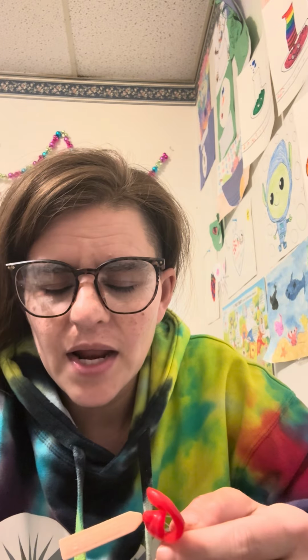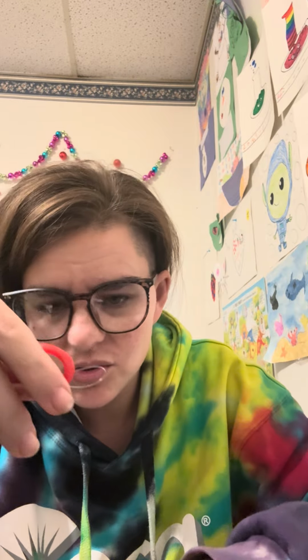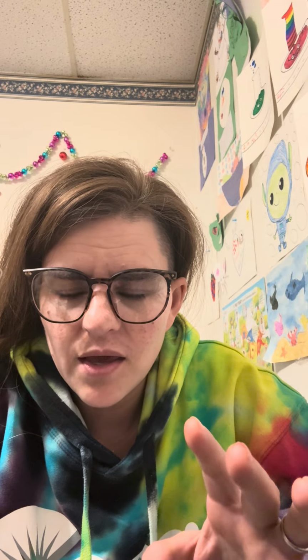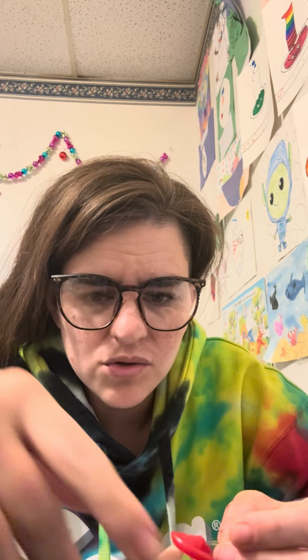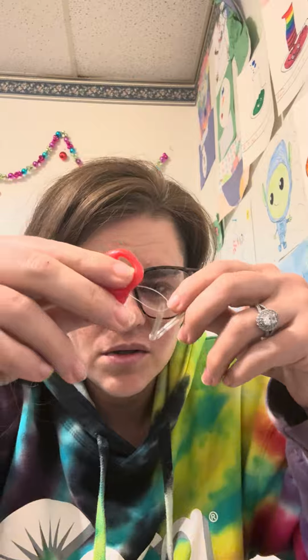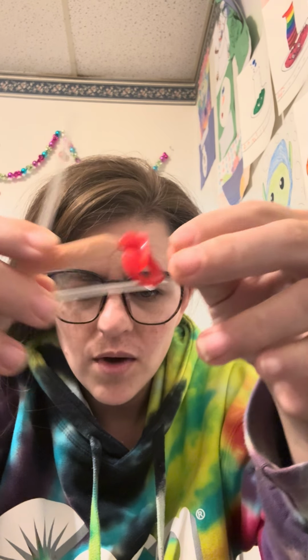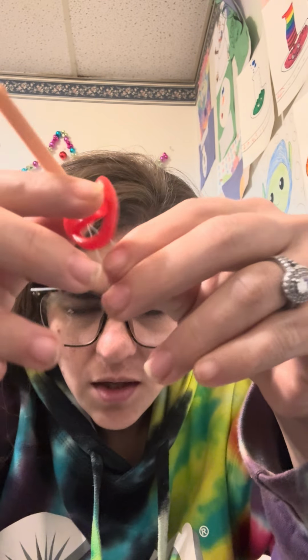A lot of that happens because your ear mold is new and stiff, or you have dexterity issues, or just difficulties pulling it through the hole. I've seen a lot of videos at this point, and even some audiologists who are making videos use pliers to pull it all the way through. I don't want to risk getting pliers near my ear mold and my expensive medical equipment. So then you pull it all the way through, okay?